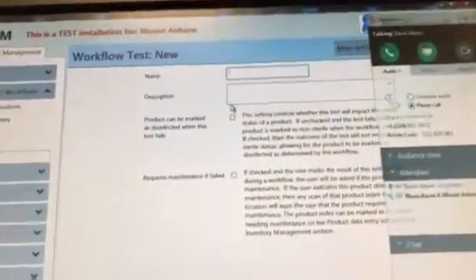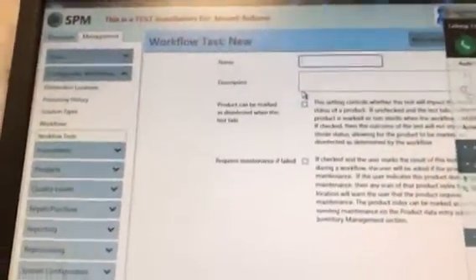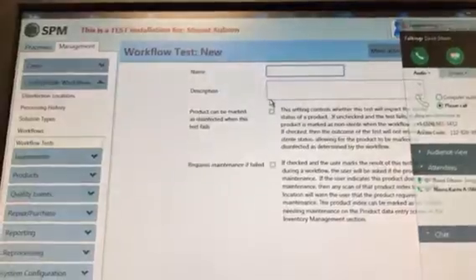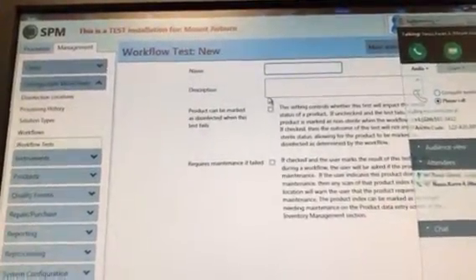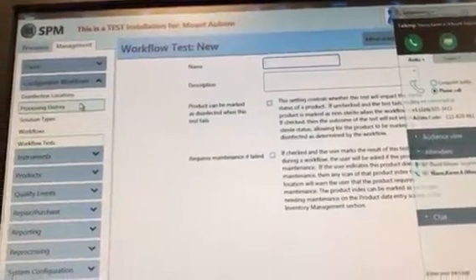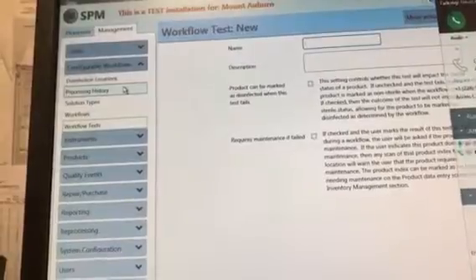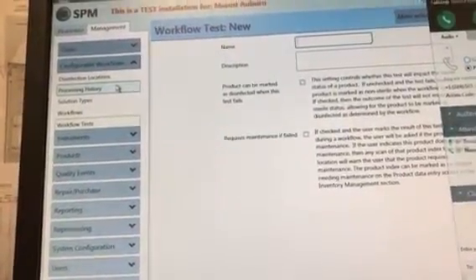Okay. So what physically is that? Is there a test strip? It's a test strip, and it needs to have an out date, and it needs to have the lot number. It's like a regular indicator that you would put in the washer or the sterilizer.